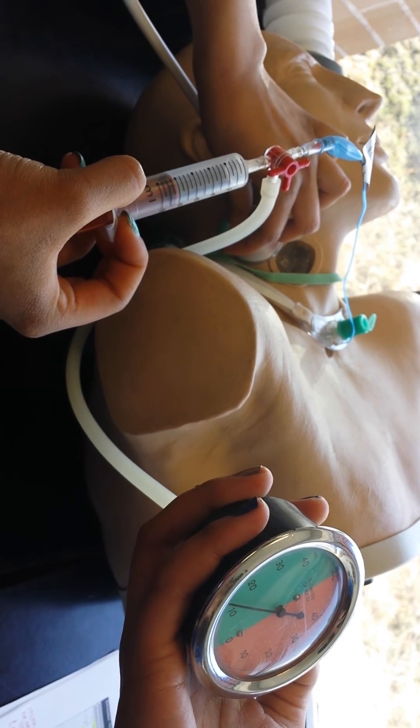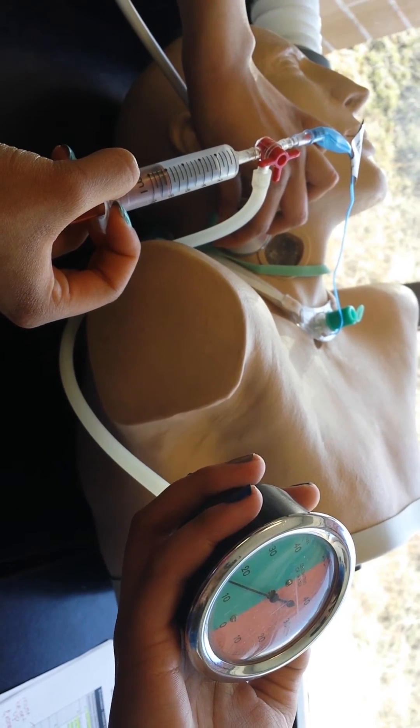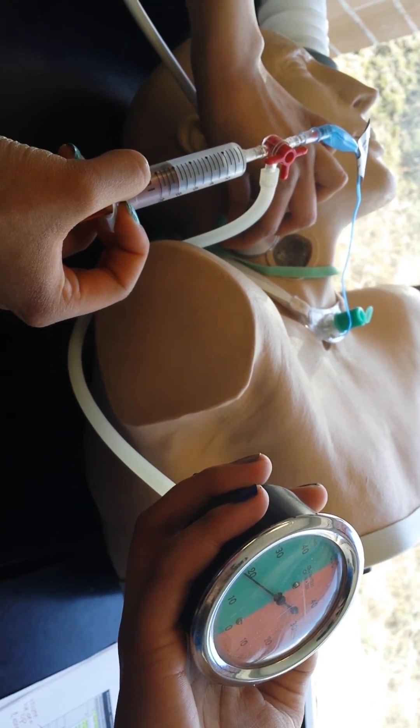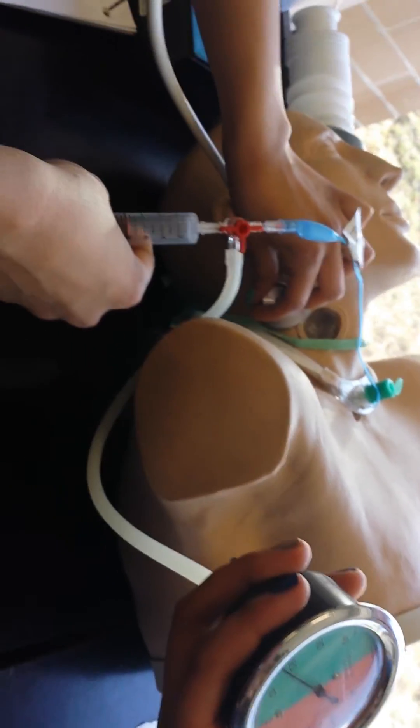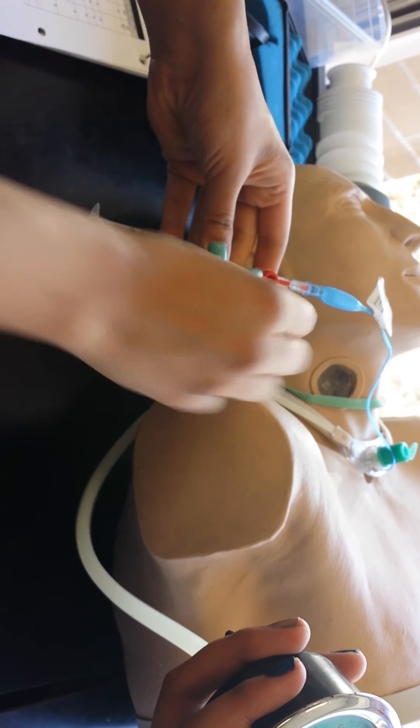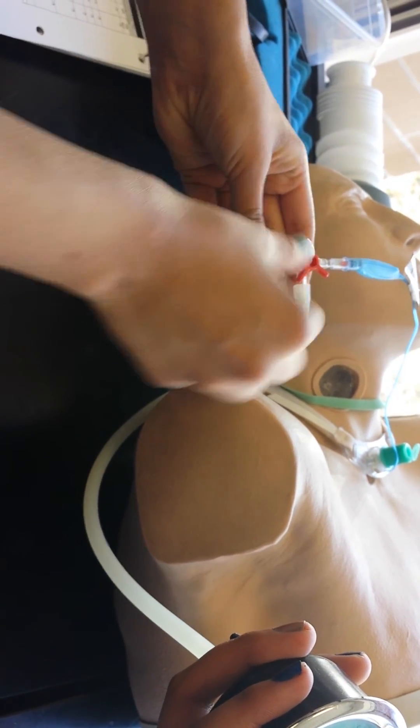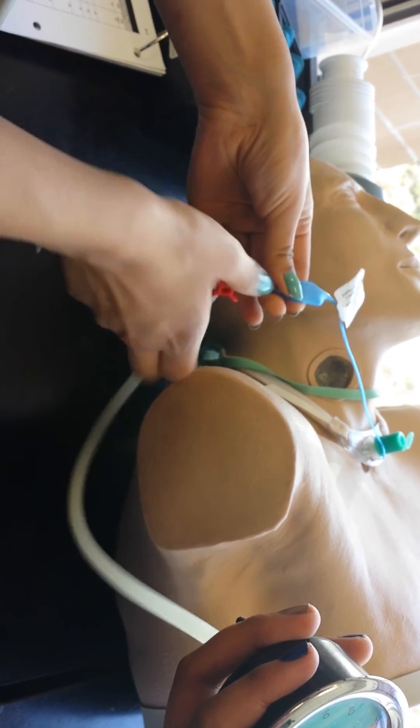And then I'm going to be like noise, noise. It's going to be like no noise. So that means that's your minimum occluding pressure. Now you're going to shut off all your ports and then disconnect from your patient.